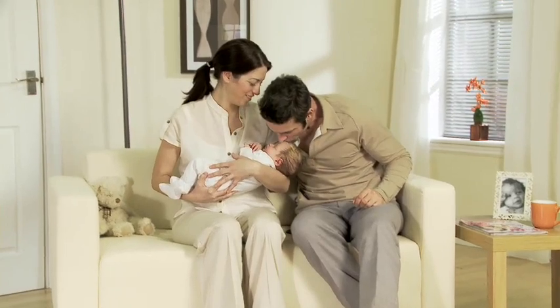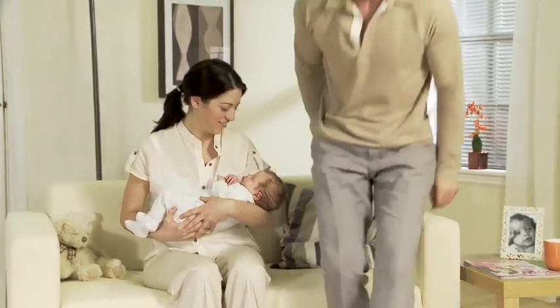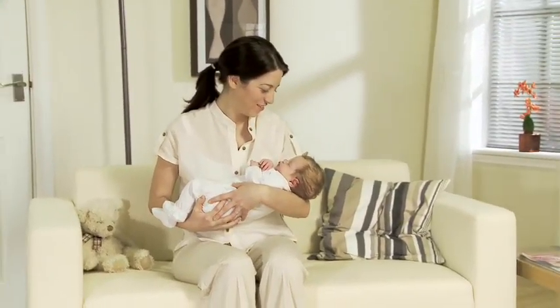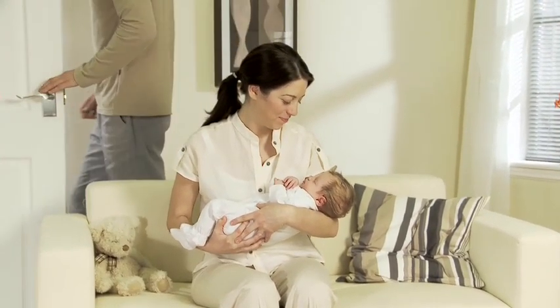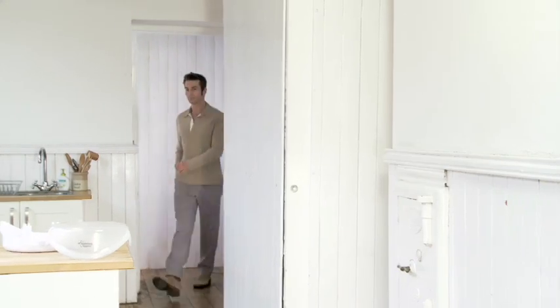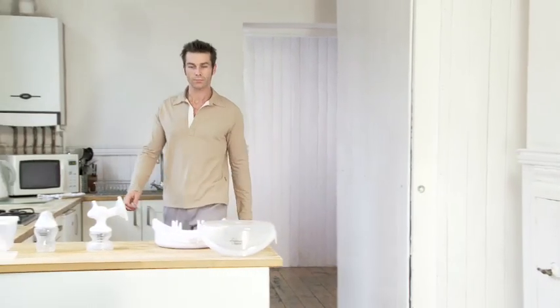Created in close collaboration with real mums, Tommy Tippy's Closer to Nature Electric Breast Pump is comfortable, discreet and easy to use. It comes with all you need to express, feed and store your breast milk, so that your baby can still have your breast milk even when you're not there.